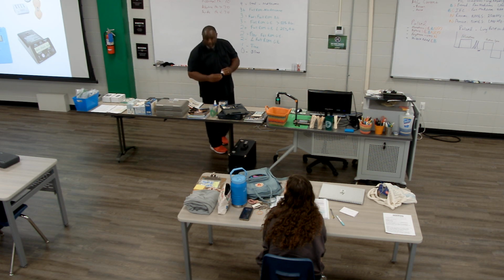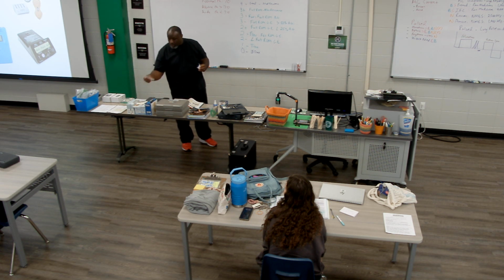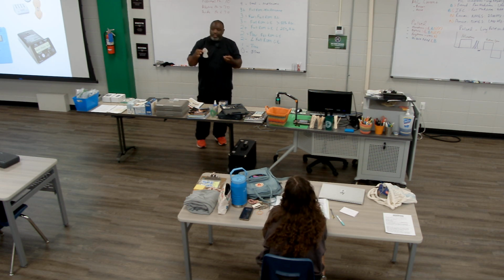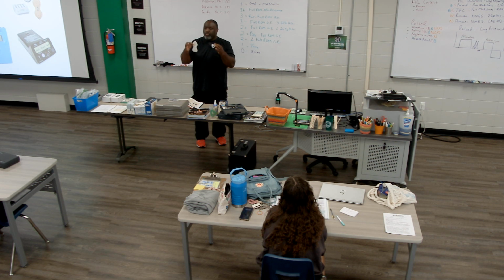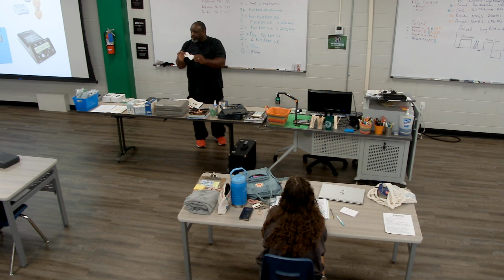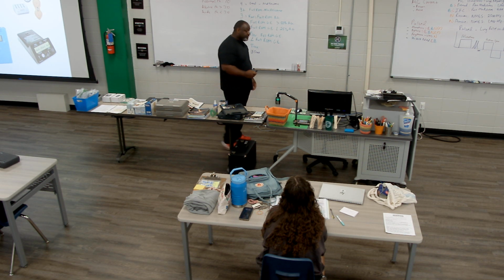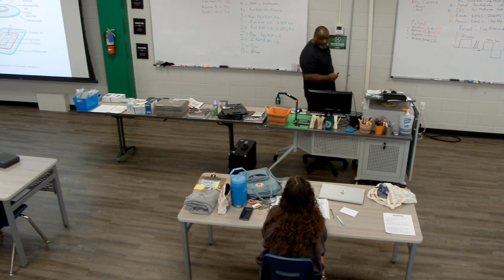So it's more of a smaller base instead of those larger machines. It uses an all-in-one electrode, and it has a controller that goes with it that I'll describe how to use in a few minutes. But these two go together. This controller clips onto the electrode like that, and then you have an all-in-one built-in dispersive and active electrode. So everything is all-in-one. And that's called Hybresis. Those are a type of electrodes.